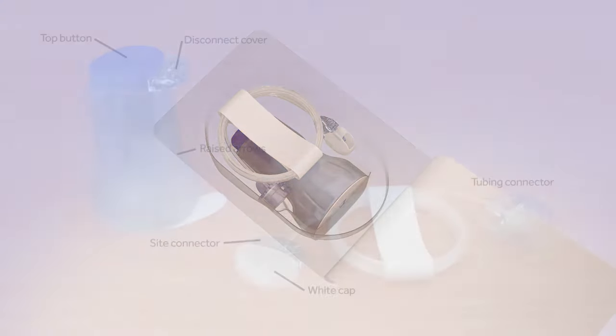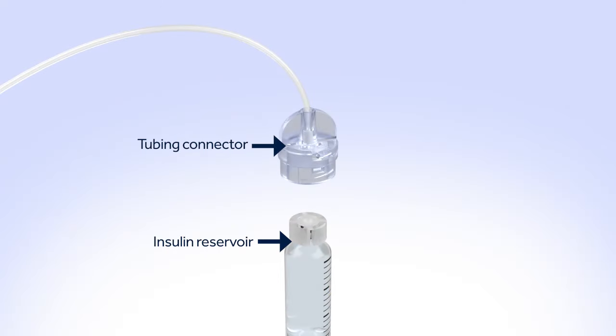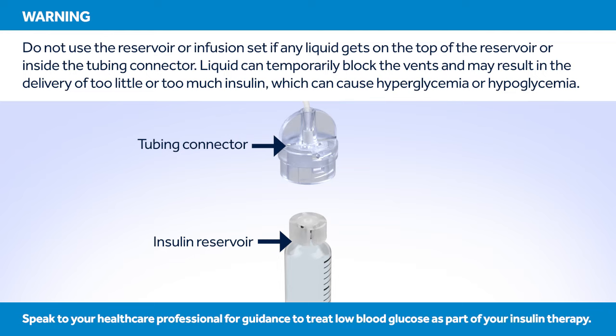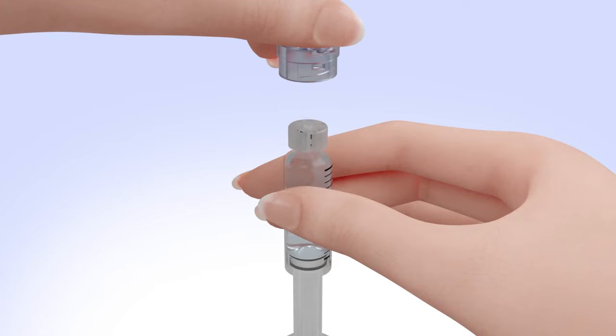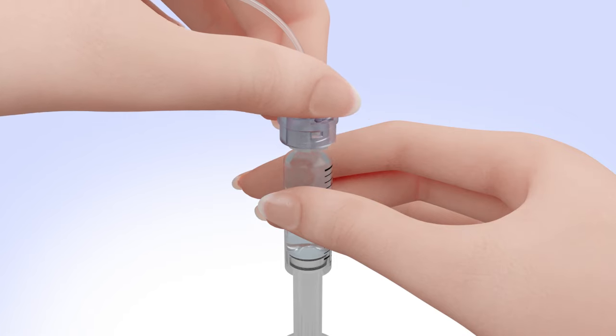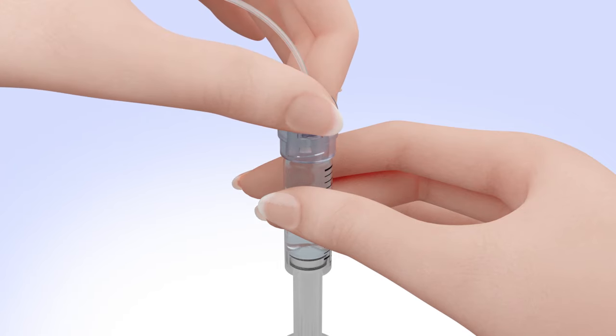Remove the infusion set from the package. Make sure both the top of the reservoir and the inside of the tubing connector are dry before connecting them. Liquid can temporarily block the vents on the tubing connector. If any liquid has gotten on the top of the reservoir or inside the connector, start over again with a new reservoir and set. Hold the tubing by the connector and place it on the top of the reservoir. Find the right position by turning and gently pushing the tubing connector until you feel it slide smoothly in place. Turn the tubing connector clockwise until the reservoir and tubing connector lock with a click. The tubing connector should not be loose or come apart from the reservoir.